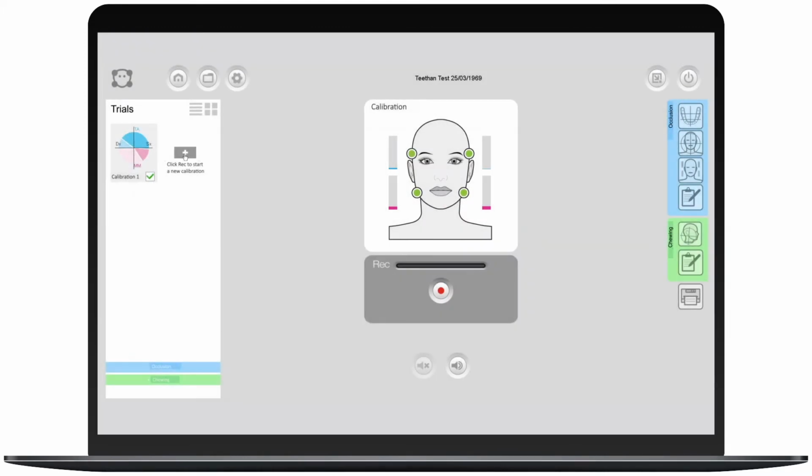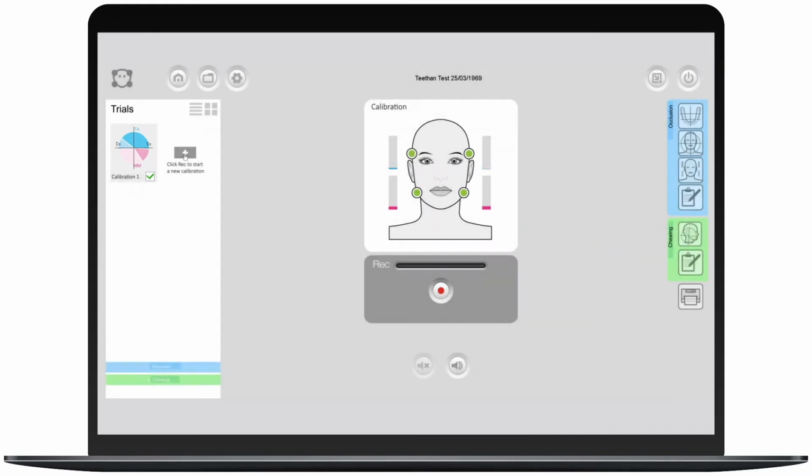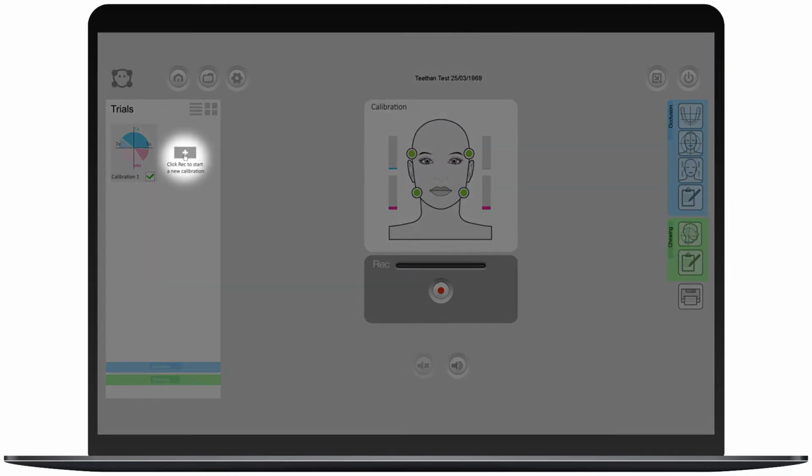At the end of the calibration test, a preview of the data required is displayed in the left panel. It is recommended to carry out and compare at least 2 calibration tests to check the repeatability of the data before proceeding to the acquisition phase. To do this, simply click the plus button and repeat the recording procedure without moving the cotton rolls.